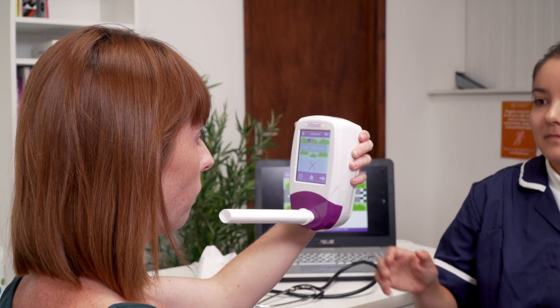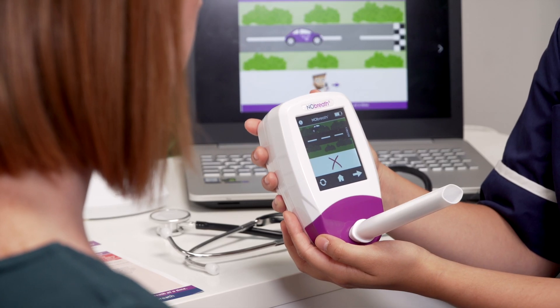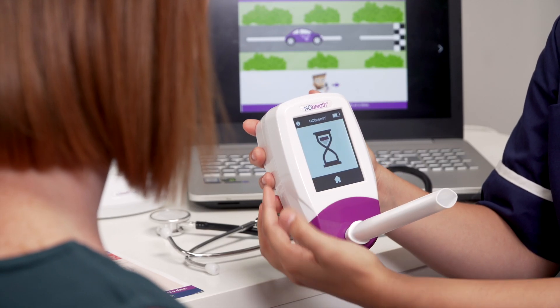Either press the retry icon to take the test again, or the next icon to view the results anyway.